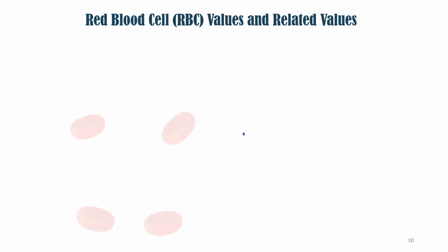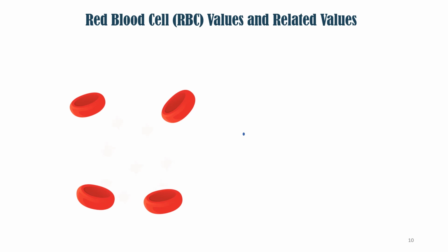Now, remember that I told you that the machine does not really recognize what is a red blood cell or white blood cell or platelet.